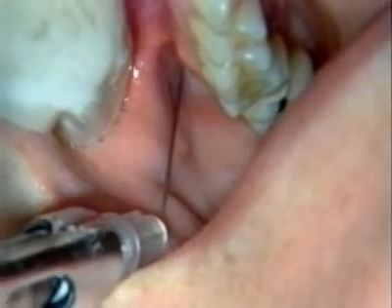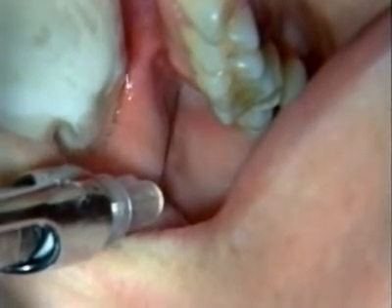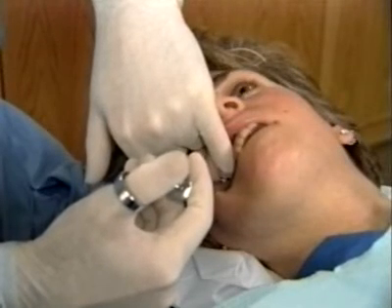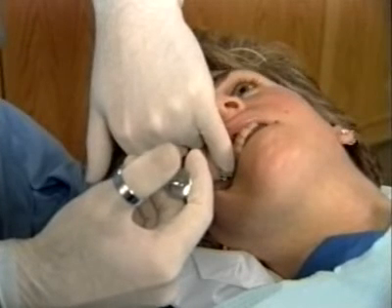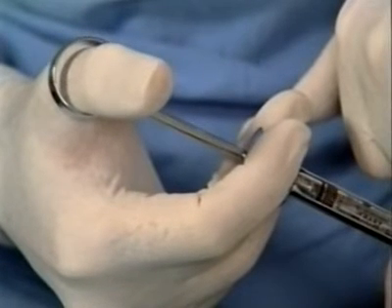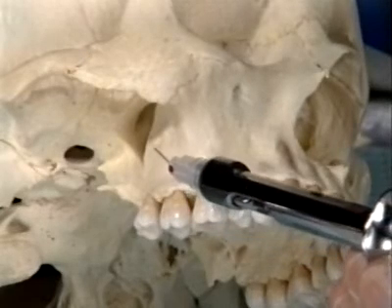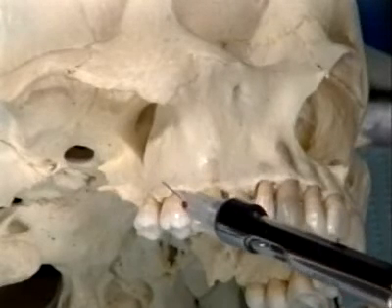The needle tip is inserted in the height of the vestibule as previously described, and slowly advanced superiorly, medially, and posteriorly along a straight path to a depth of 30 millimeters for the average adult. After a negative aspiration, the entire contents of the 1.8 milliliter cartridge is slowly injected. Premature contact of bone requires that the needle be withdrawn before being reoriented to minimize the chances of hematoma formation.